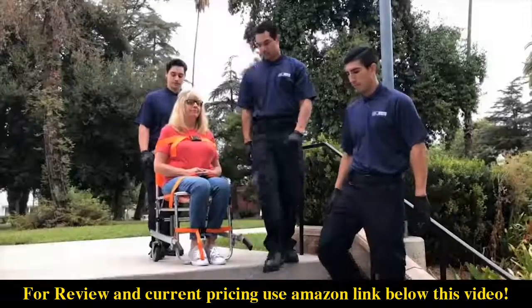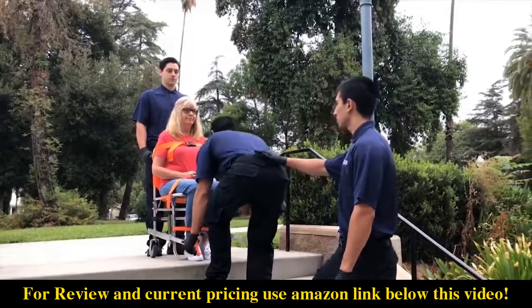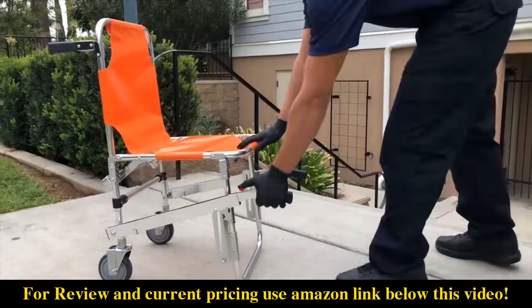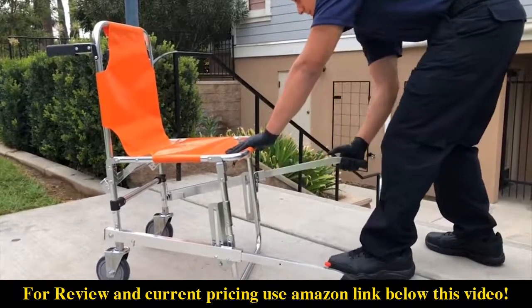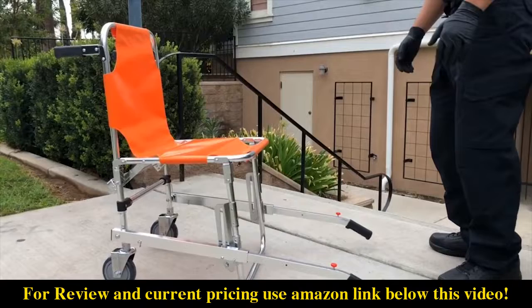The front and rear operators then move to their positions at the front and rear of the chair. When carrying the chair on stairs, both operators should face the patient. The front operator presses down on the front carrying handles until they lock into place, then extends the front handles by pushing the red release button and pulling the handle out until it locks. The front carrying handles are now in moving position to operate.